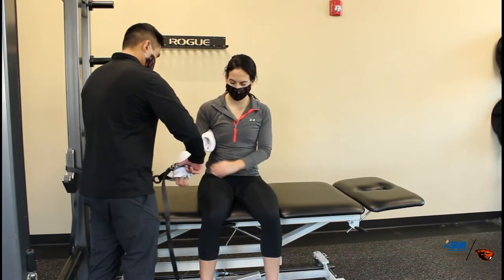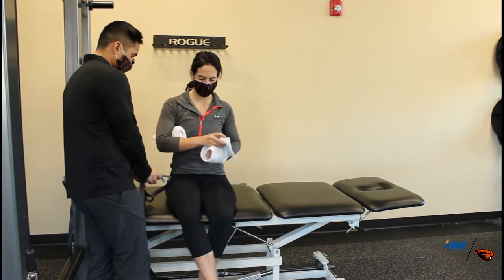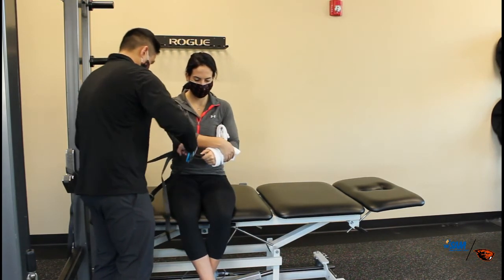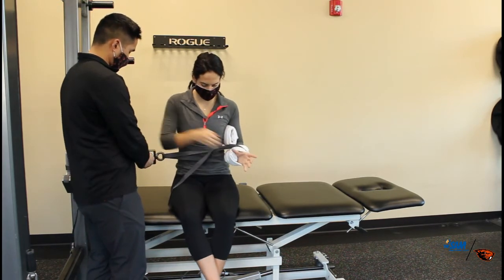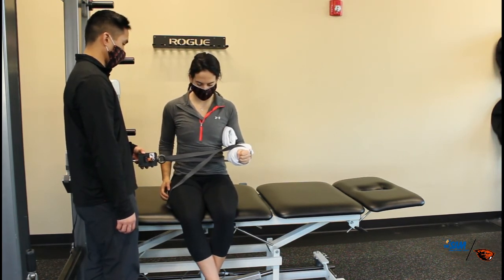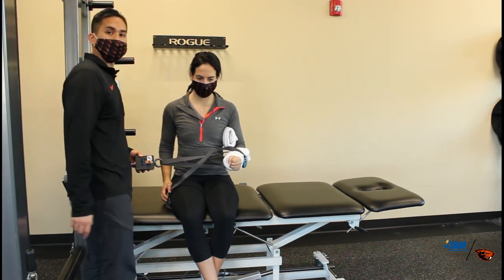To move into external rotation, I'm going to have her move to the other arm. Move a little closer. I'm going to extend one of these straps and test that setup. Perfect. Same idea — Heather, go ahead. One, two, three, and rest. Then we're going to switch her to facing the other way and test the other arm.